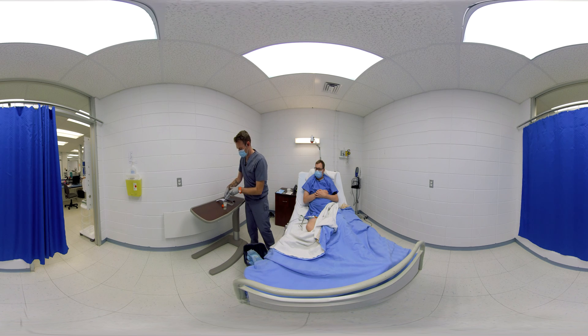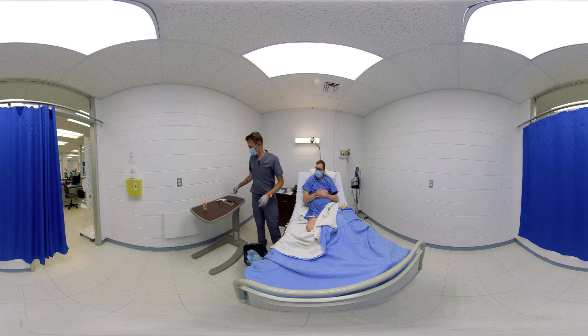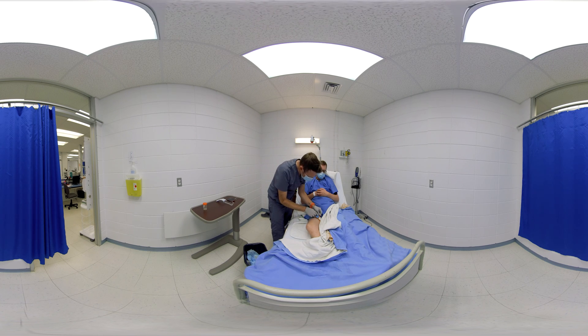Screwing the cap tightly on prevents any potential leaks. The nurse checks the amount of liquid in the urinary catheter's balloon — this information is written on the catheter. This check is to make sure the balloon has been completely emptied before removing the catheter, which helps to prevent any injuries or trauma.